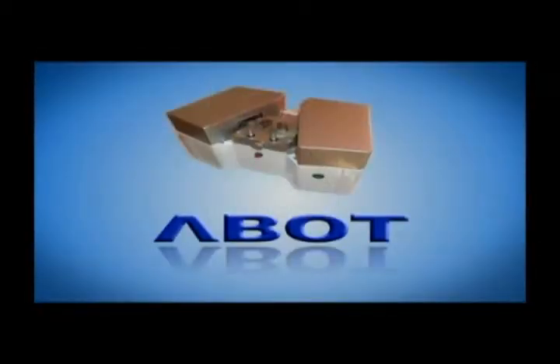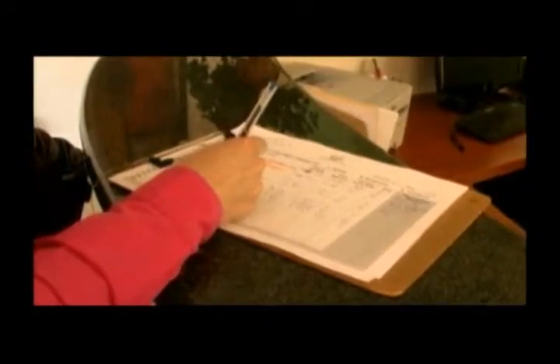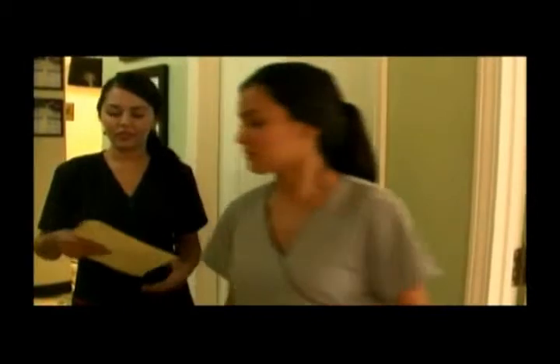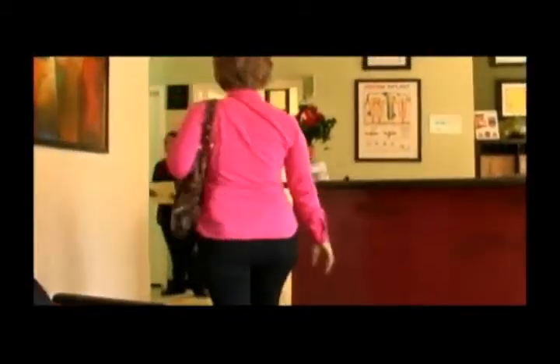What would a Lamdabot experience be like in your lingual orthodontic practice? It begins as usual with a patient walking into your clinic for the first time. The well-deserved personal treatment starts from when the patient arrives at the reception desk where the new clinical file is created. The relationship of confidence between patient and doctor is established and strengthened when the professionalism of your staff becomes evident.